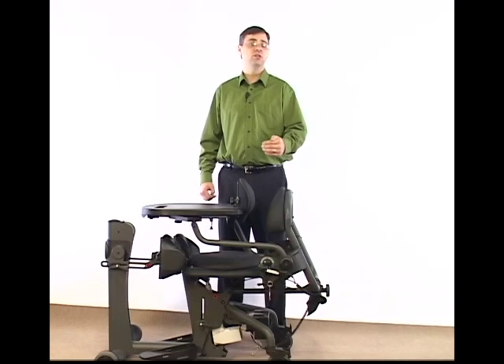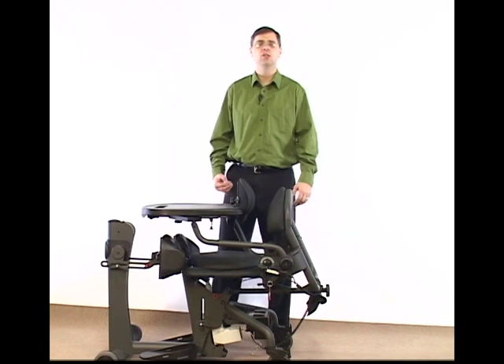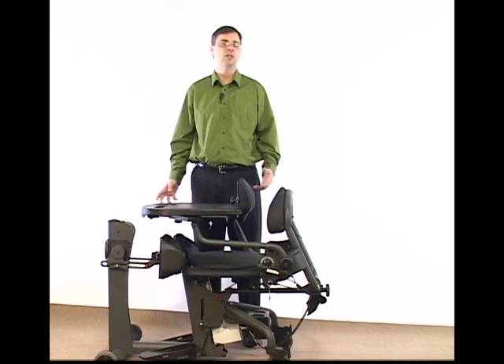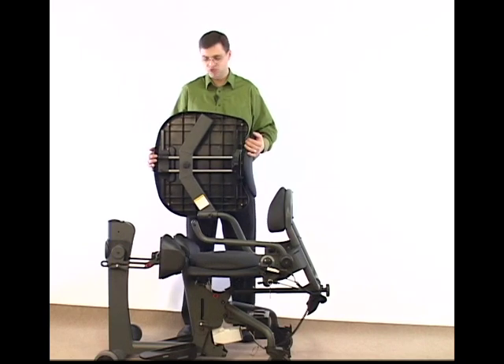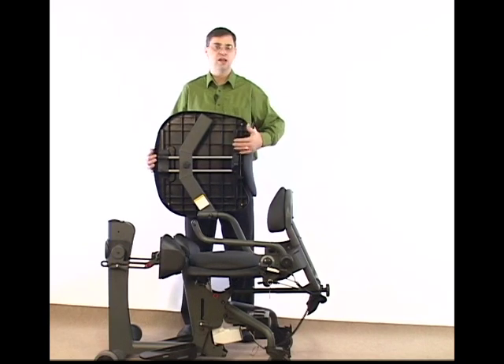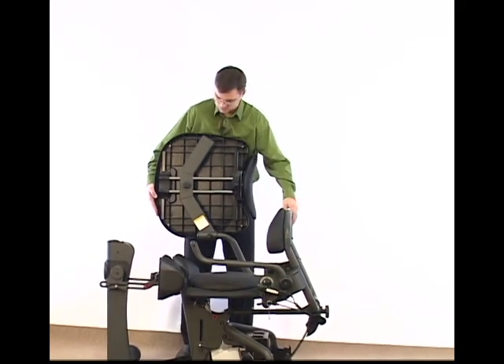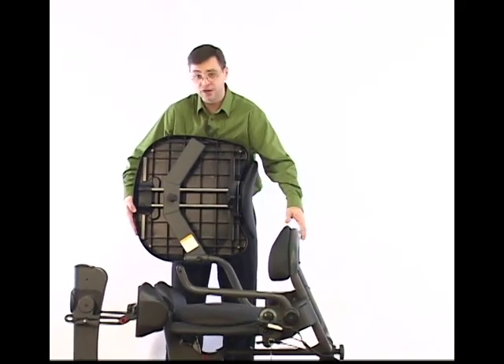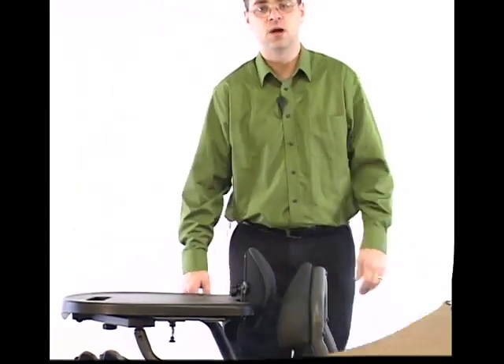Setting seat depth is important both for transferring in and out of the unit and as you transition from sitting to standing. In order to make the seat depth adjustment as easy as possible, let's do a couple things to prep. First, I want to take and move my shadow tray adjustment as far back towards the back as possible. To do that, I loosen the knob, slide the table back, and then set it back down.